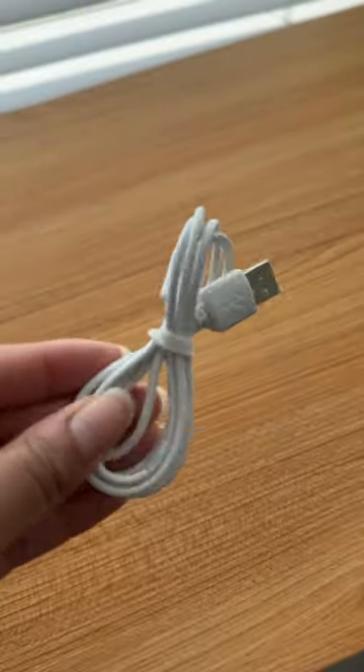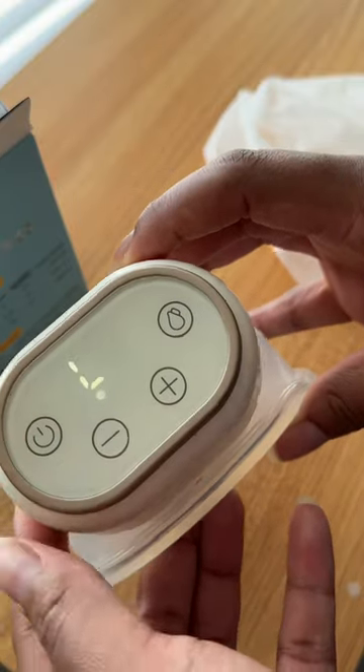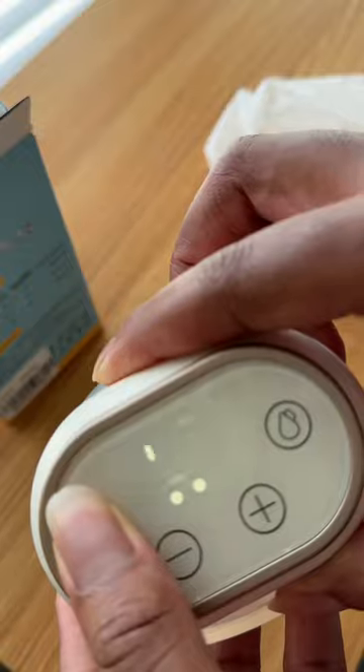This wearable pump features 3 modes to choose from with up to 8 different suction levels. I have been enjoying the pause feature and the battery life for whenever I'm on the go. It is super easy to wash and sterilize the parts and reassemble together, so let's see what we got!